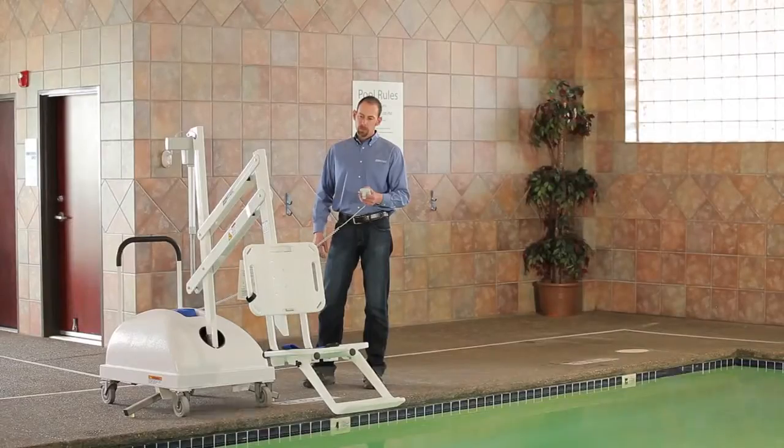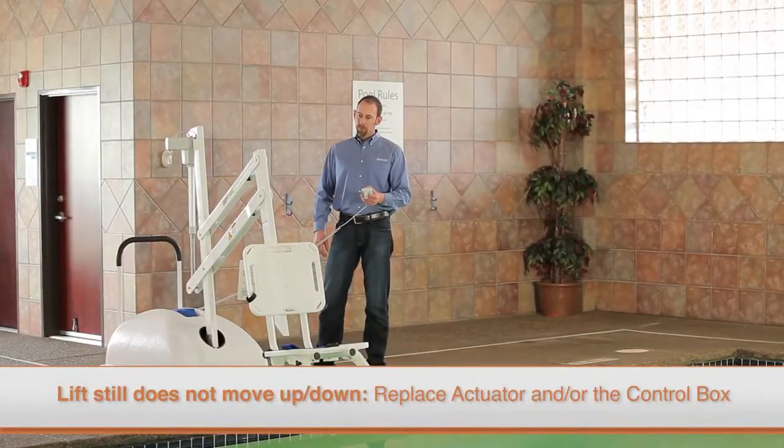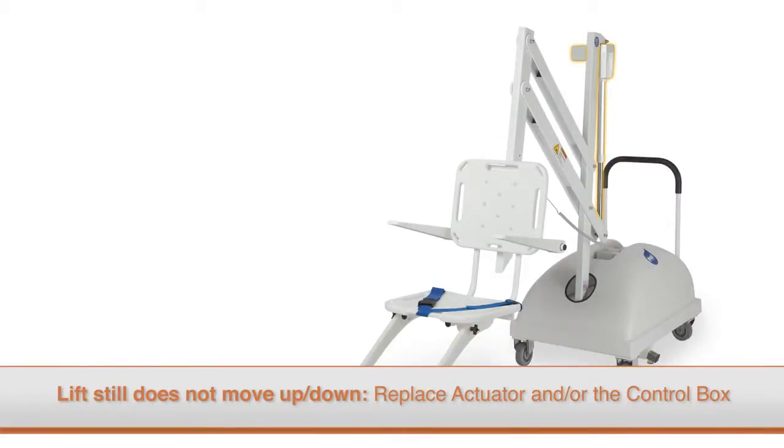You will need to remove the lift from service and replace the control box. If the lift will still not move up and down after completing this test, you will need to replace both the actuator and the control box.